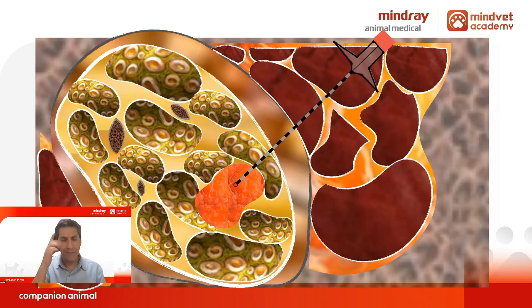So keep in mind two important things. The first, we need to stop the needle near the nerve, but we need to avoid needle-nerve contact.